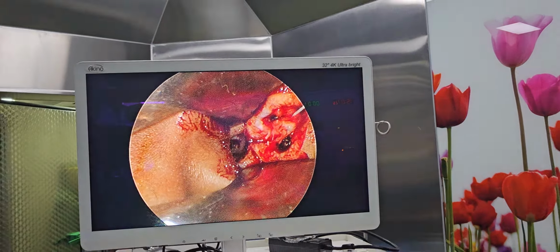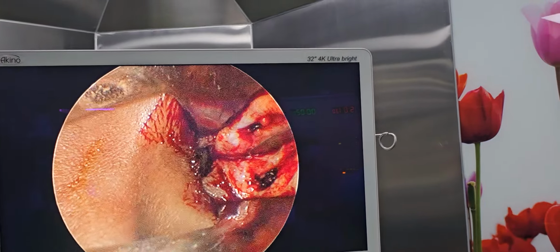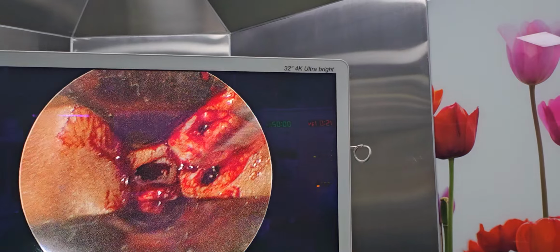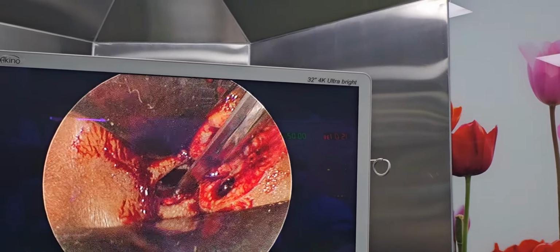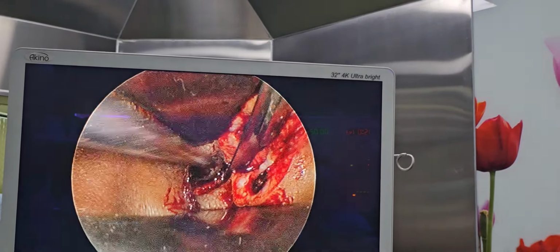What kidney shaped cavity is associated with this? Okay. Yes, that's the bone, still hitting the bone. So this was our suction procedure. This was our first incision, right? See this one. Now, this is a very important incision.